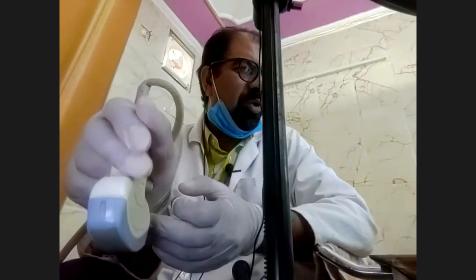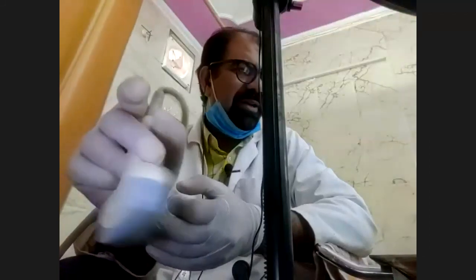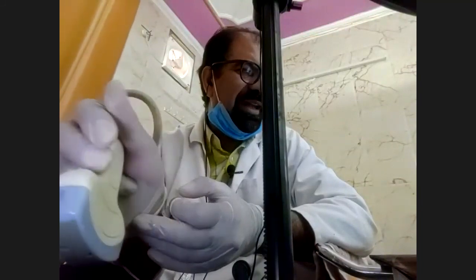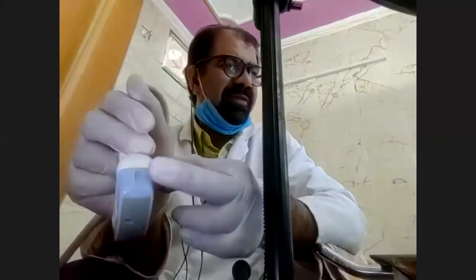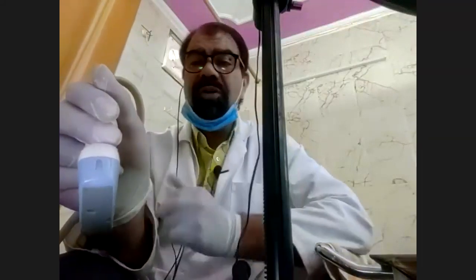It is the clockwise rotation of the probe. It means that from transverse section, I have to take a clockwise rotation to get the longitudinal section. Clear? It means this indicator will now face towards the head or towards the toe of the patient.